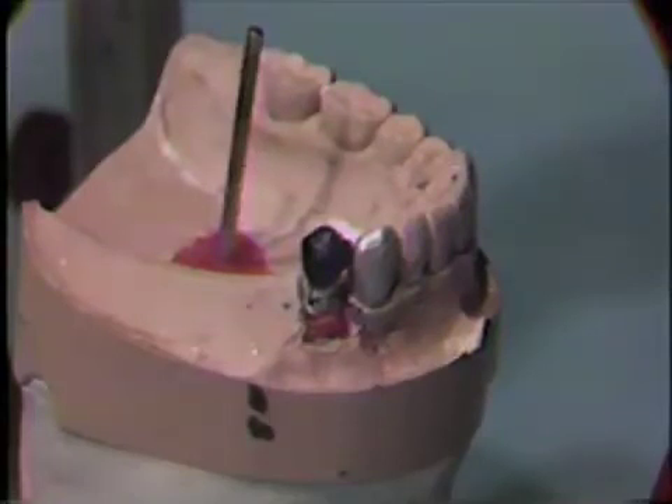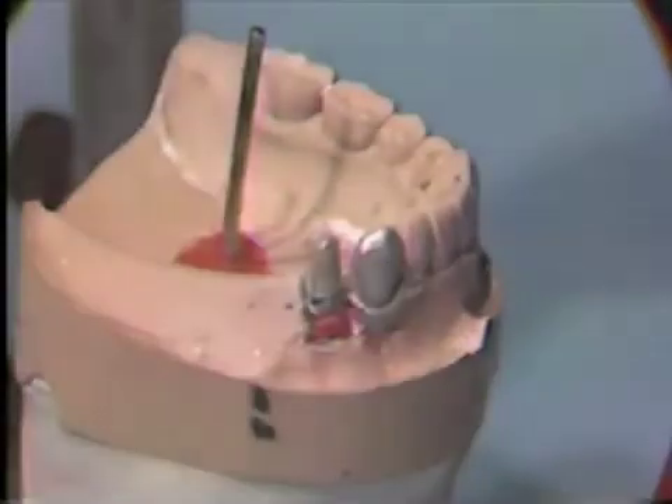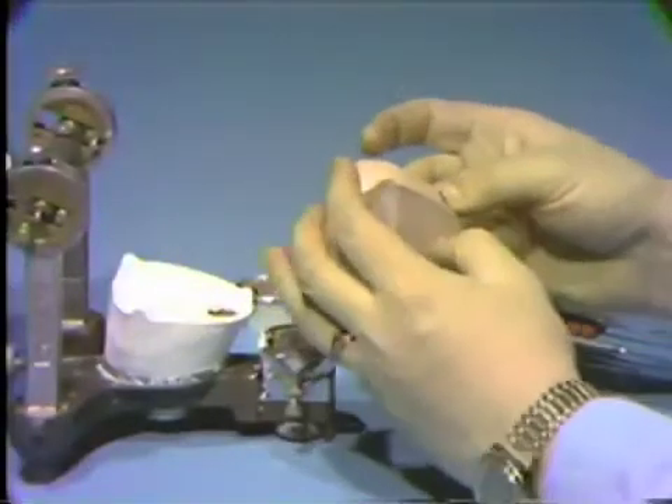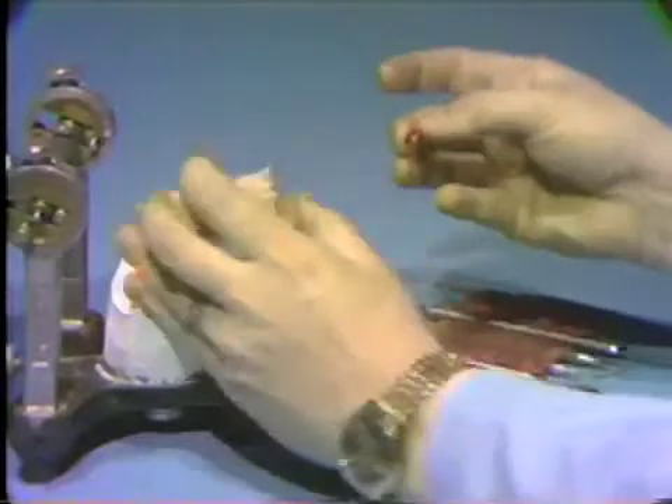The wax up of the crown must begin with an acceptable die mounted securely in a work model which can be transferred from the articulator to the surveyor and back again to the same path of insertion and removal. The working cast with a removable die should be placed on the articulator in its correct relationship. This should be simple if the casts were mounted correctly.